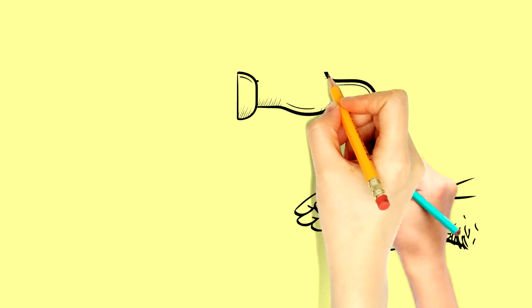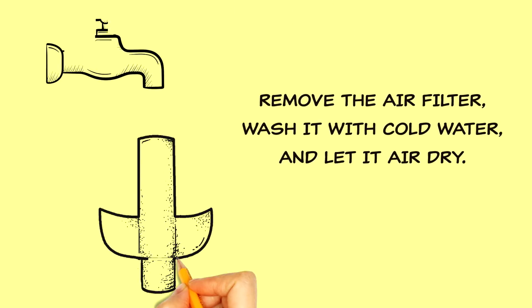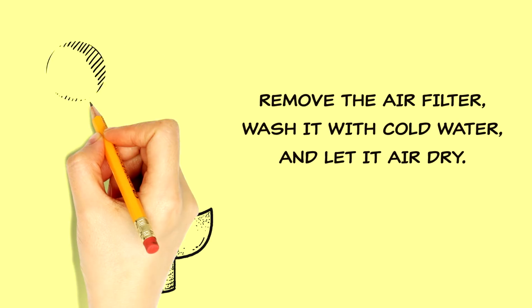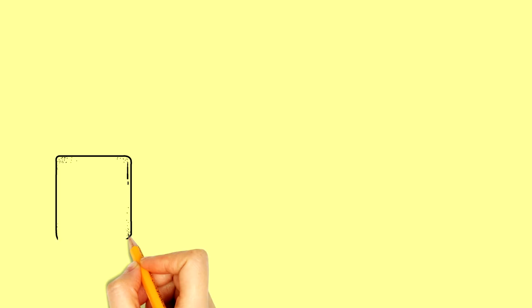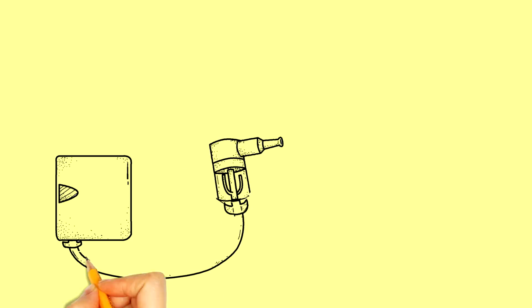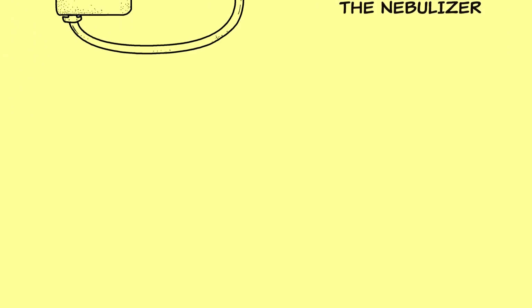First, wash your hands properly to avoid any cross-contamination. Next, remove the air filter, wash it with cold water, and let it air dry. Then, plug the filter into the nebulizer.